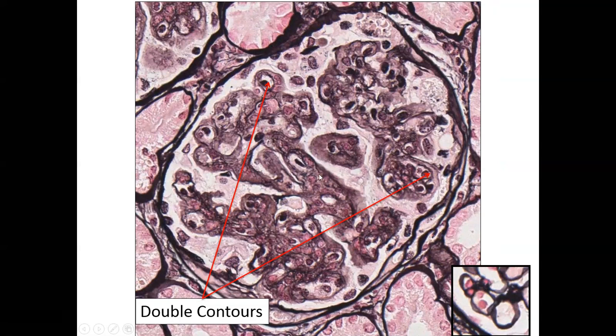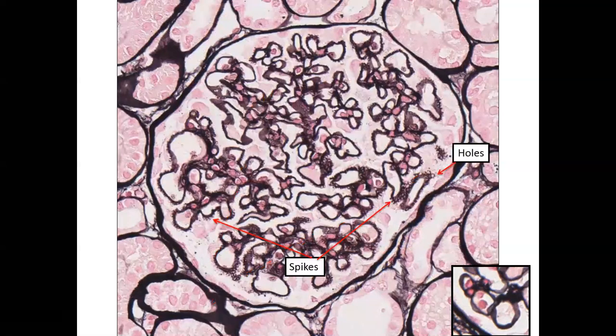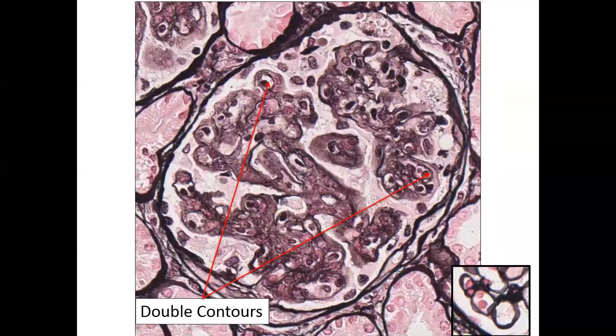When I look at these kinds of cases on EM, these immune complexes for this type of disease, these subendothelial immune complexes, they're usually quite variable in size, and they can be quite large. We often talk about how they become confluent with one another. So it's not like in this disease where they're discrete immune deposits sitting in between spikes. And I will show you EMs of all of these, I promise.